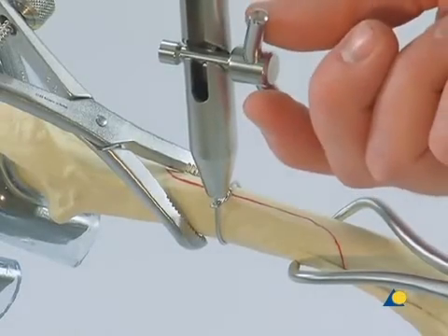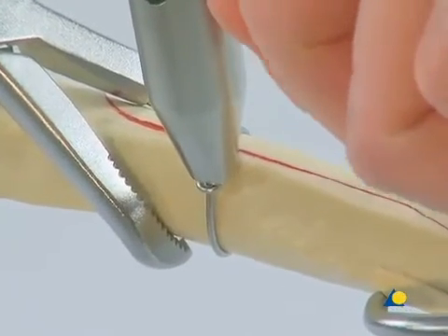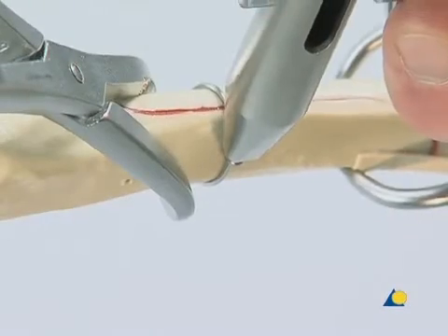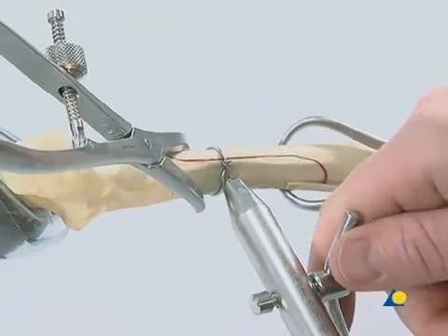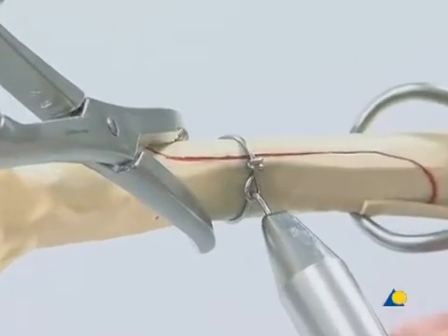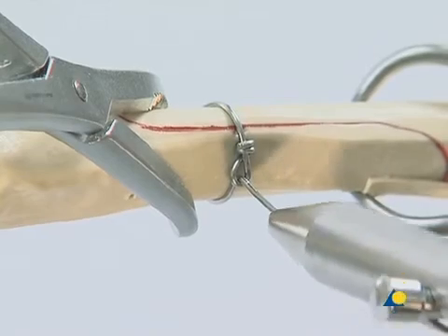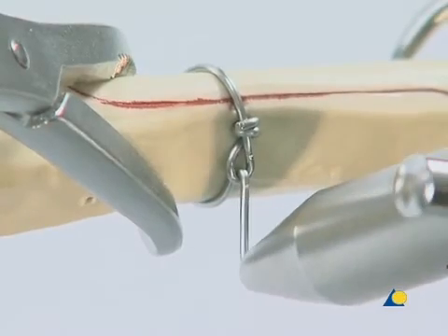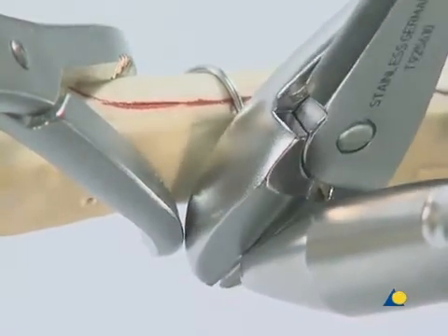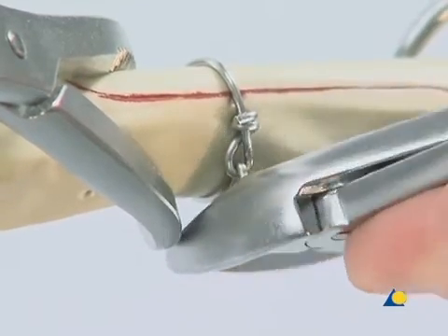The peg is turned to tighten the wire, and tension is maintained by keeping pressure on the peg handle. The wire tightener is bent over at least 90 degrees to lock the cerclage in place. While pulling on the wire tightener, the peg is turned in reverse to release approximately 1 or 2 centimeters of wire, which should be kept under tension. The wire tightener is straightened up while its tip is pushed down towards the bone to form the arm which secures the cerclage. The wire is trimmed close to the tightener, and the arm is pressed to the surface of the bone using an instrument.